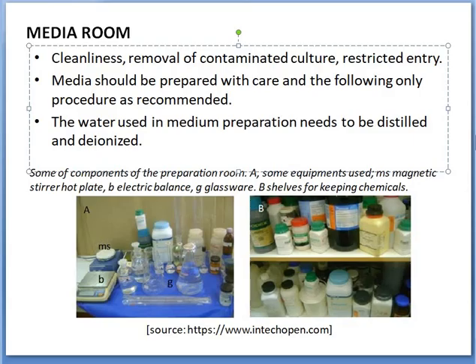Generally, media rooms are maintained with restricted entry of people. Media needs to be prepared with utmost care and following only the recommended procedures without deviations, so as to lead to successful tissue culture process. The water that is used for media preparation needs to be distilled water, and many times sterilized water also is preferred for media preparation.